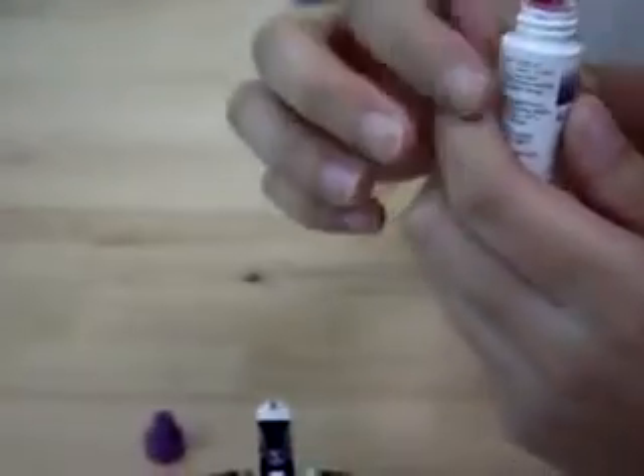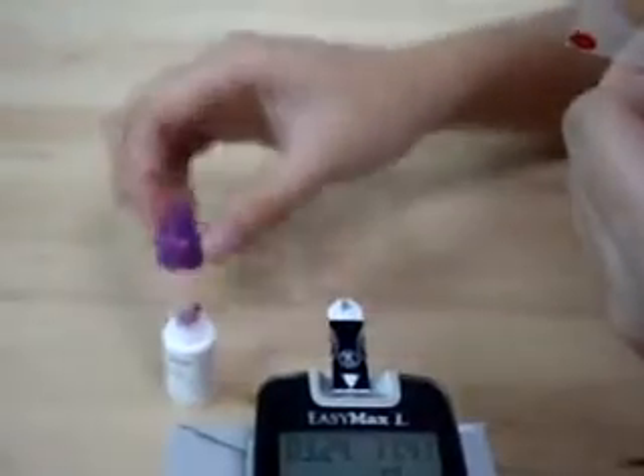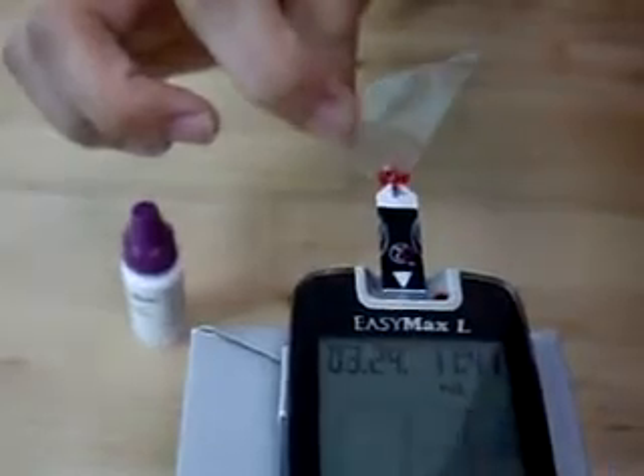Open the control solution bottle. Remove the first drop of control solution. Then place the second drop on a flat surface. Touch the drop to the tip of the test strip.